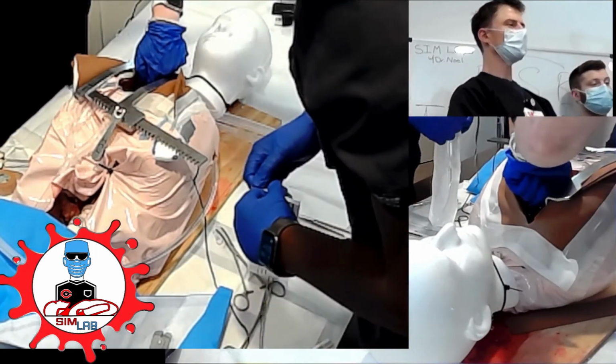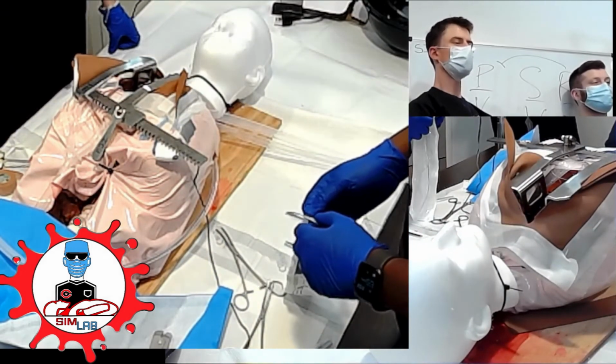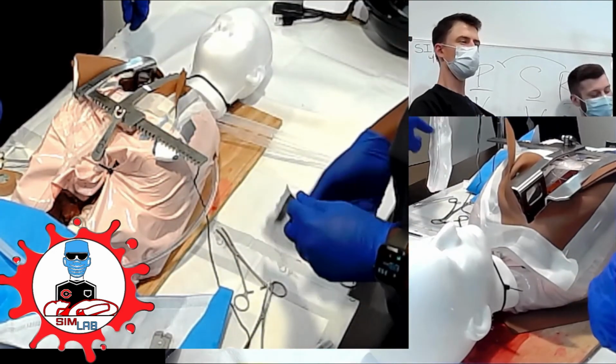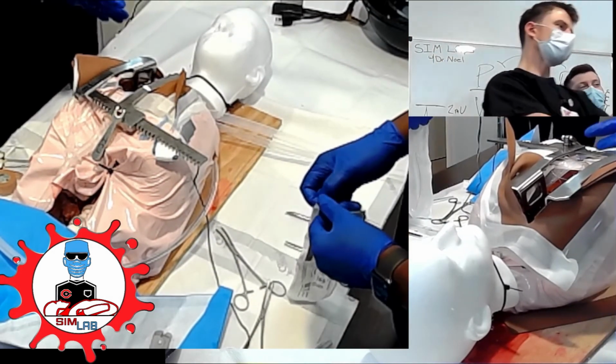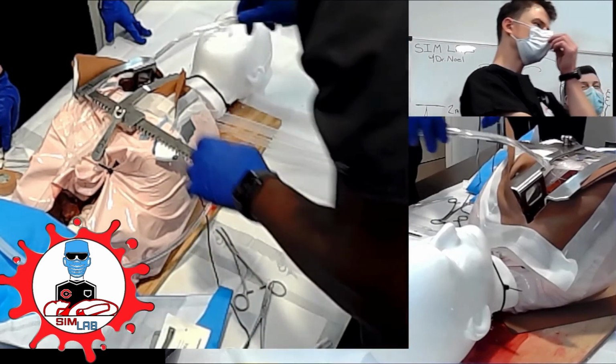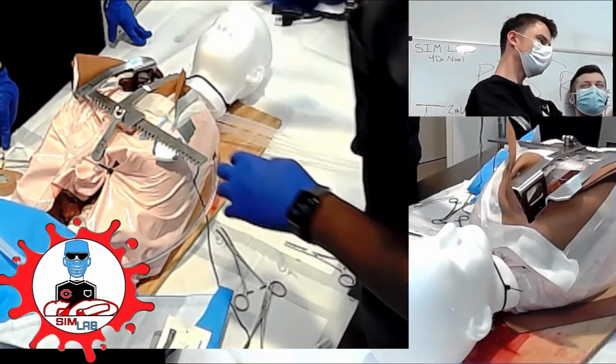Okay, so we open the heart, looks like there's tamponade and blood clots around the heart. Okay. So we just suction and see if we can get anything out. Yeah, so essentially you're just going to have your sterile suction, so you're suctioning out, right? See if you can alleviate the tamponade.